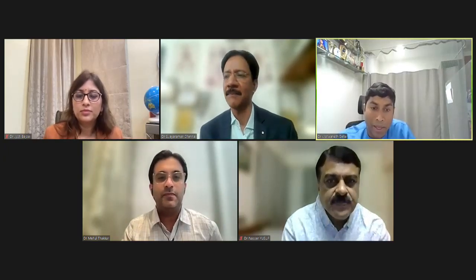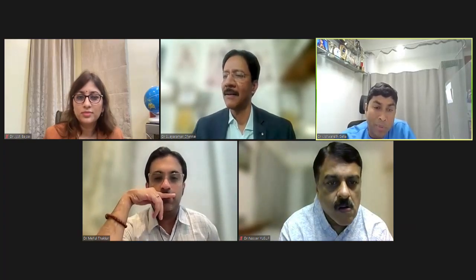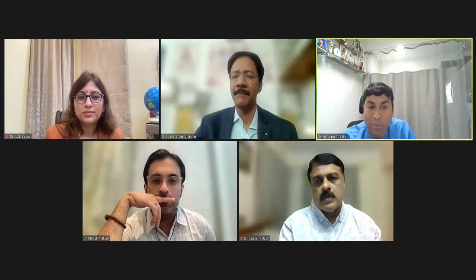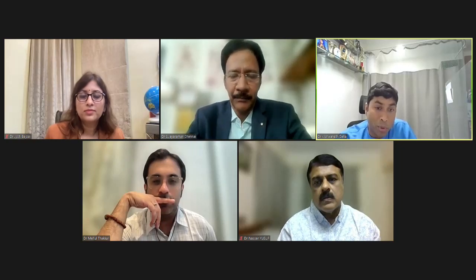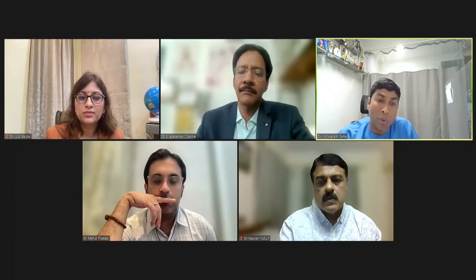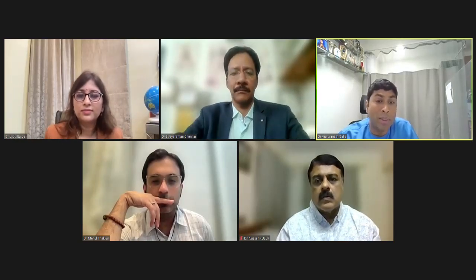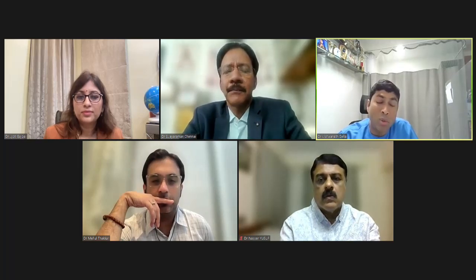I would say it's a very, very useful tool in the armamentarium of the pulmonologist, both in critical care and in pulmonology. In critical care, you have a lot of patients with lung collapse, mucus plugging and bleeding, especially patients on ECMO. Earlier we used to take out mucus plugs or blood clots with forceps. It would take us 45 to 50 minutes, sometimes hours, to remove the clot when there was a whole lung collapse. With cryo, it has become very easy to clear lung collapse and bronchial blockage. So in the ICU, it's going to be very useful.